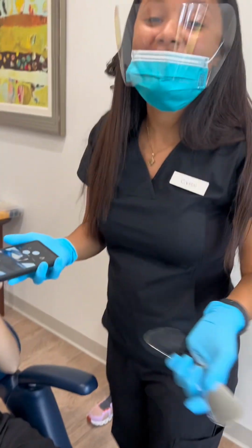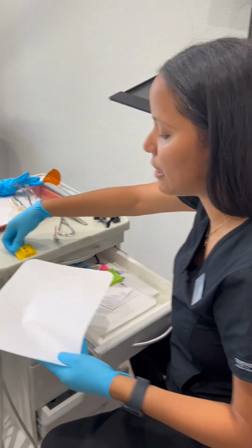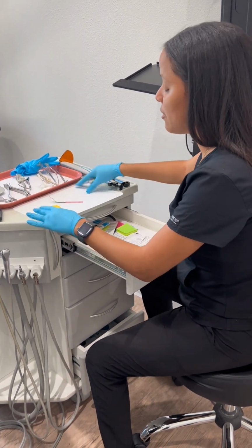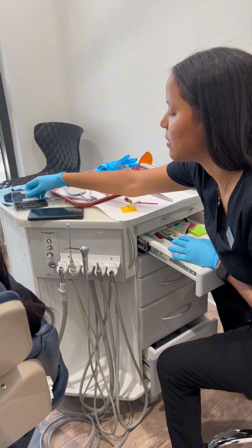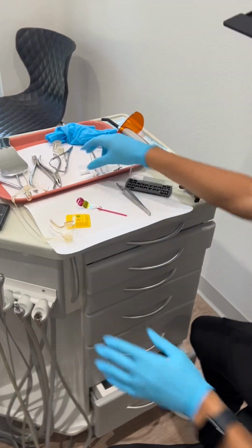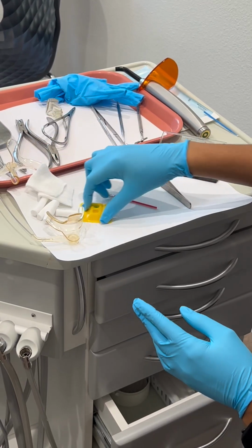And that's how you take the initial records. Setup is going to be like this, and the setup is really important because while you're in the patient's mouth, it's not really convenient to be grabbing stuff or to be having to get up and get stuff. So you really do want to be prepared as soon as the patient is seated in your chair. And this is how I like to set up my bondings, just so that you can see. So first things first, obviously we need to keep the area dry, so I have my cheek retractors. And with the cheek retractors, I always have some cotton rolls, and I always have some 2x2s, and you'll see why in the near future here.